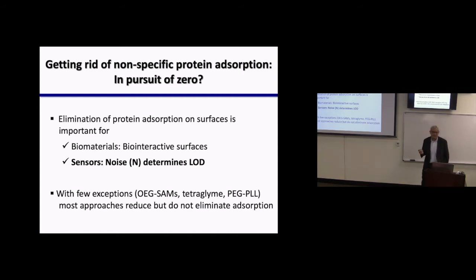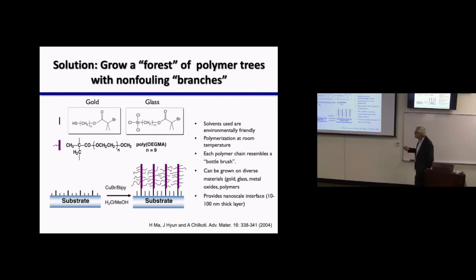What you want is a technology, a solution to get rid of protein adsorption from any given surface, where glass would be really important. A lot of things are made on glass, and plastics. Those are the two kinds of materials you'll be using to build chips for diagnostics.